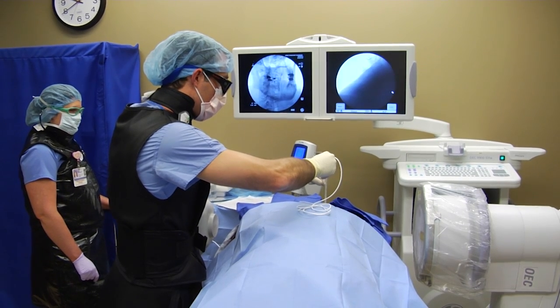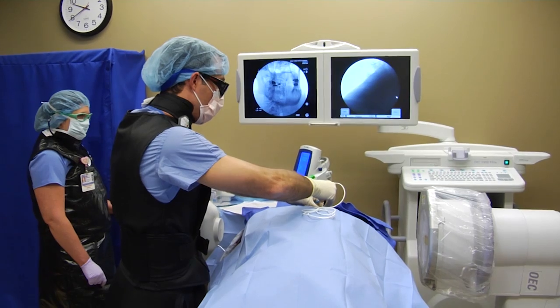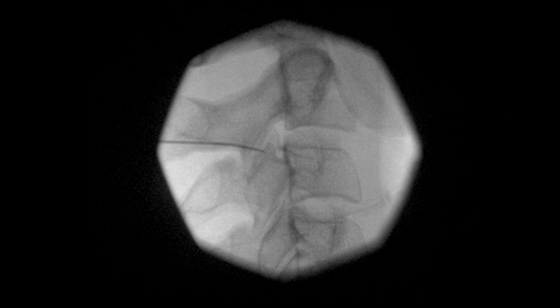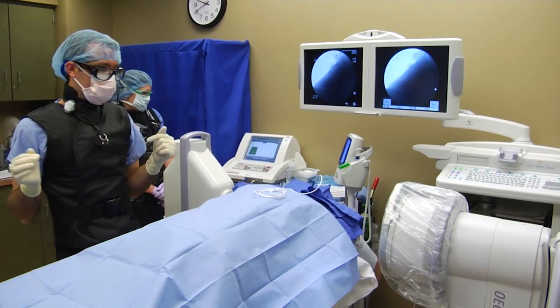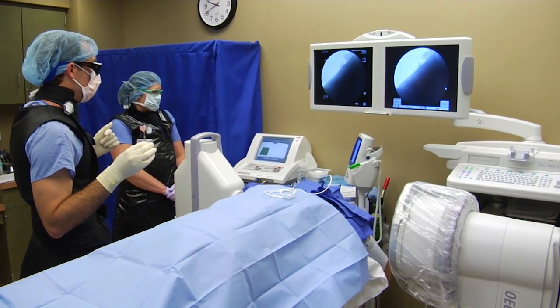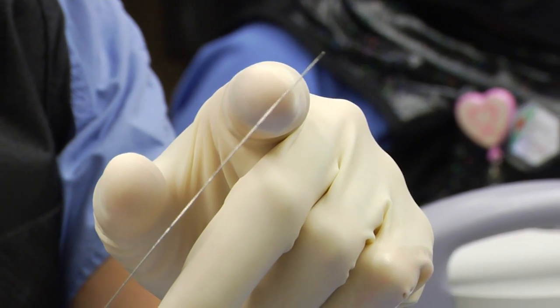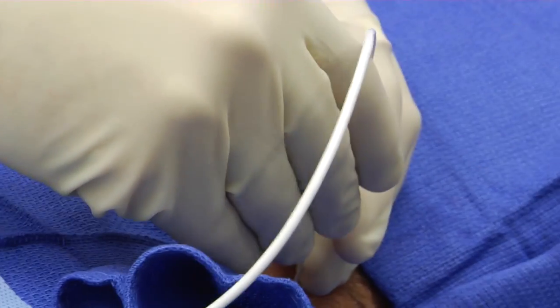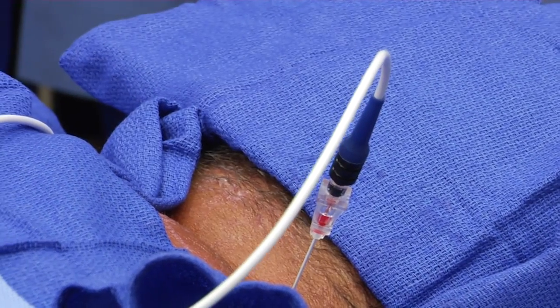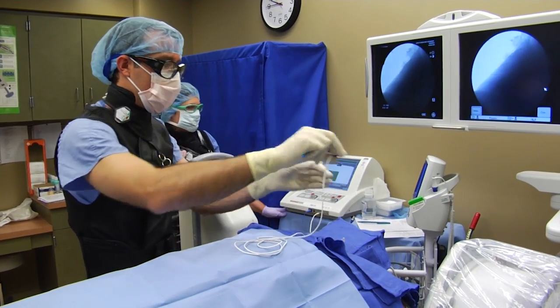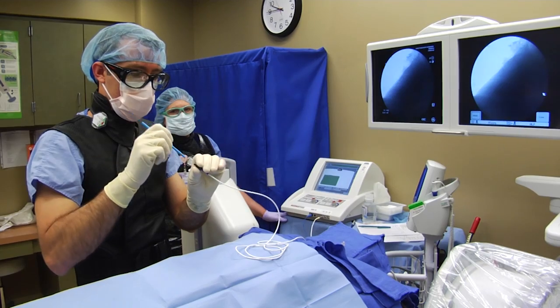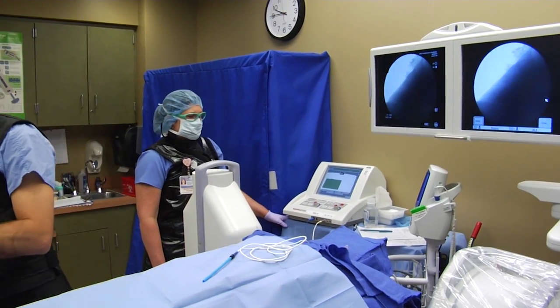After removing the trocar and reinserting the inner cannula, I perform the appropriate sensory and motor testing as previously described. Then, I inject my 1-milliliter solution prior to creating another thermal lesion using the same temperature and duration — 80 degrees Celsius administered over 90 seconds. We can visualize the 1-centimeter active tip of the inner cannula, which creates the radiofrequency lesion. At this point, my needle tip is rotated approximately 180 degrees, and the same process is repeated. Prior to each radiofrequency lesion, a fluoroscopic lateral view shows the needle tip remaining in the same testing position and posterior to the neuroforamen.